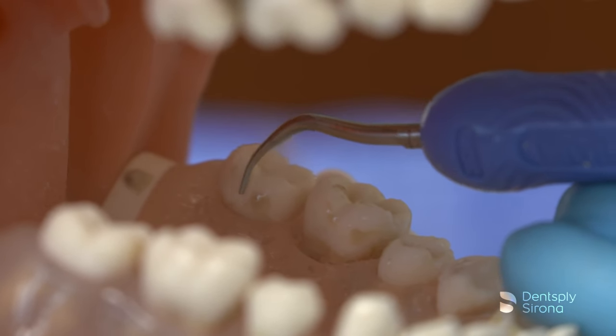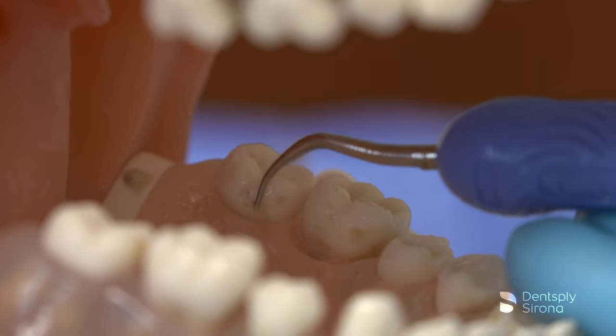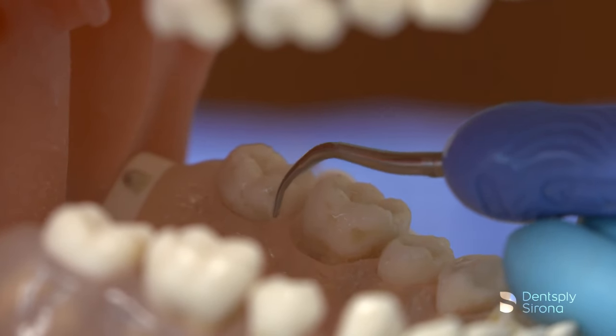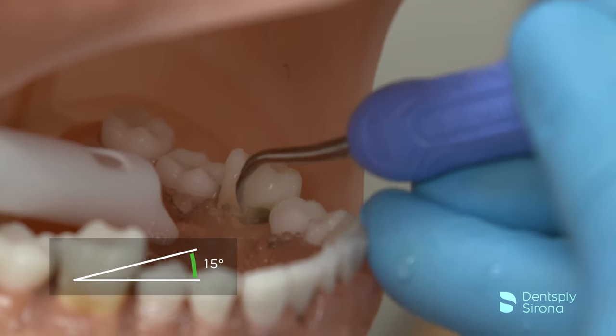The clinician will start by adapting the lateral surface of the Cavitron FSI-1000 on the clinical crown and uses the back and/or face of the insert tip as needed. Utilizing a transverse orientation, maintaining 2-3 mm of adaptation and 0-15 degrees angulation.